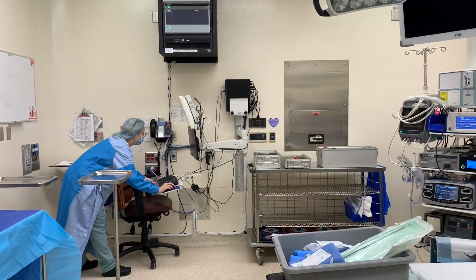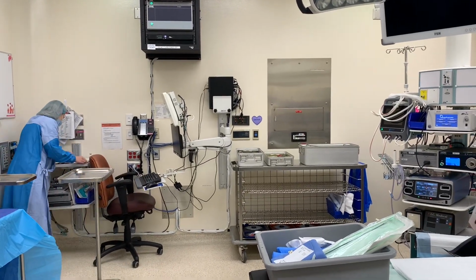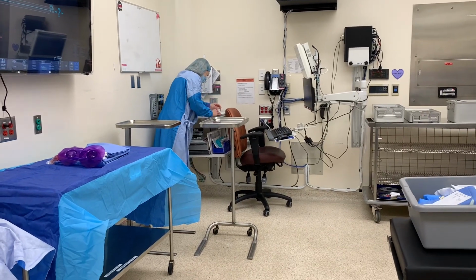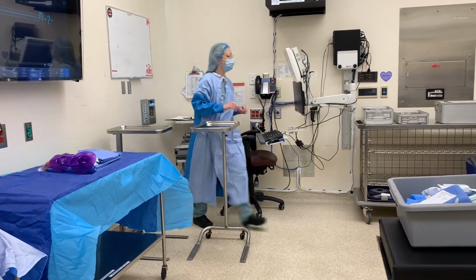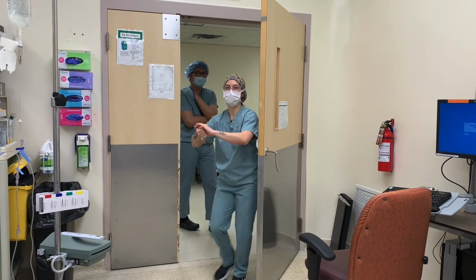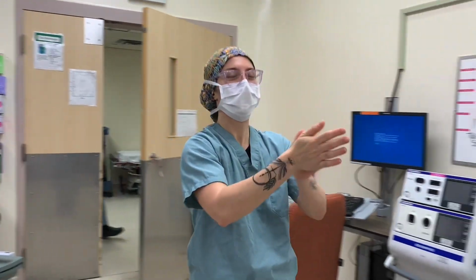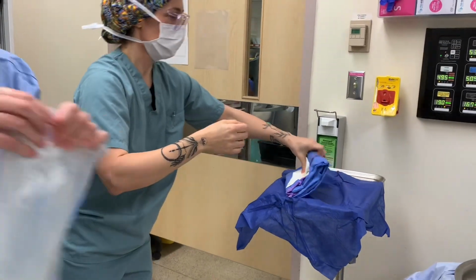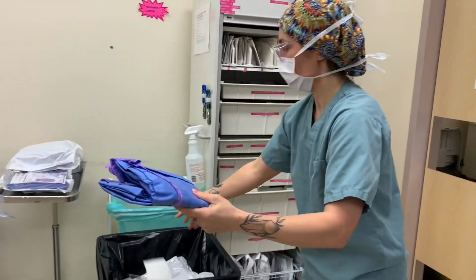This is just a video to suggest a few other ways to prioritize your room while working together as a scrub and circulating nurse team. While the scrub nurse is scrubbing, the circulator is checking the preference card, making sure the sutures and the local were correct, and then she left to retrieve some irrigation. Here comes our scrub nurse, ready to rock. She doesn't have her gloves, so you'll have to open those for her.